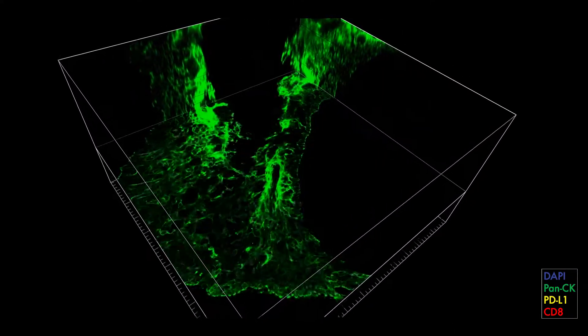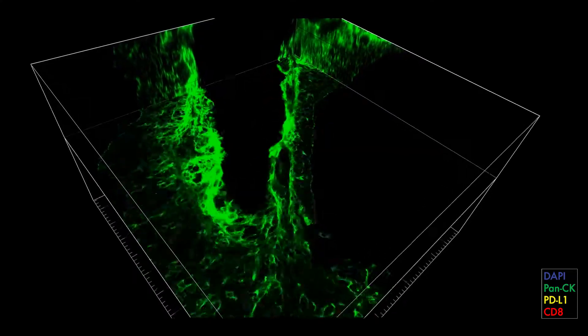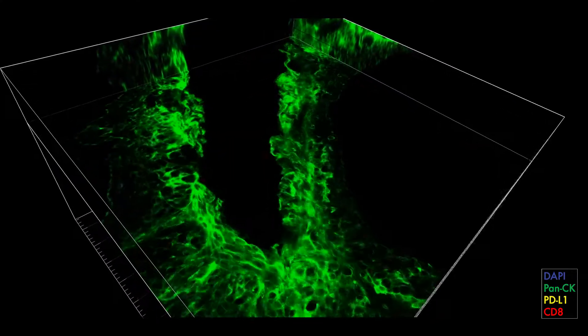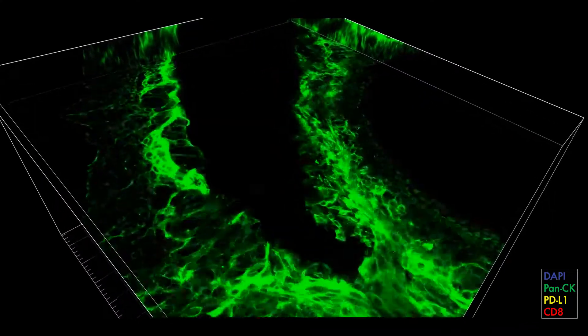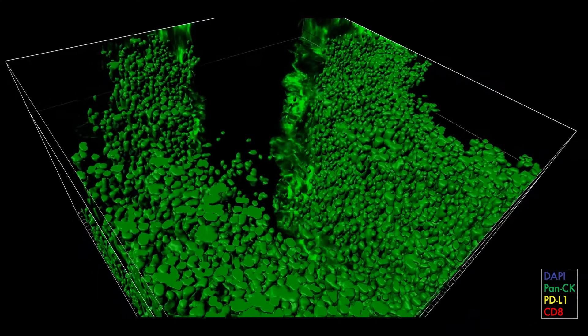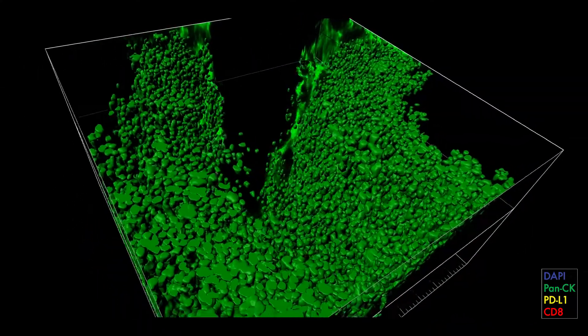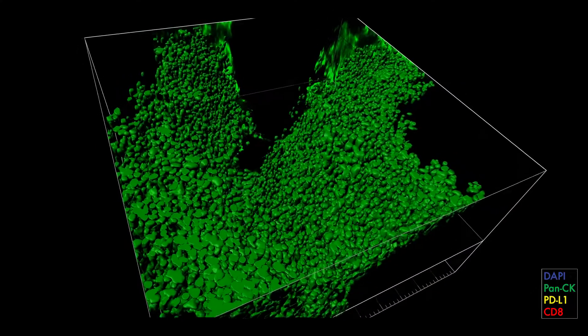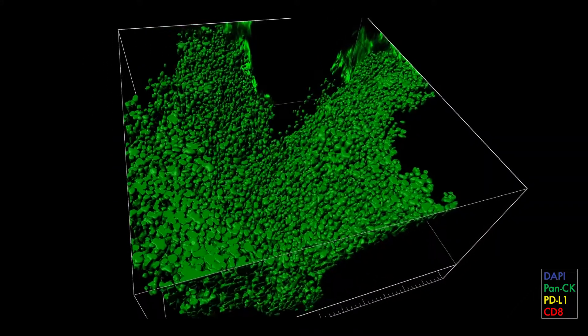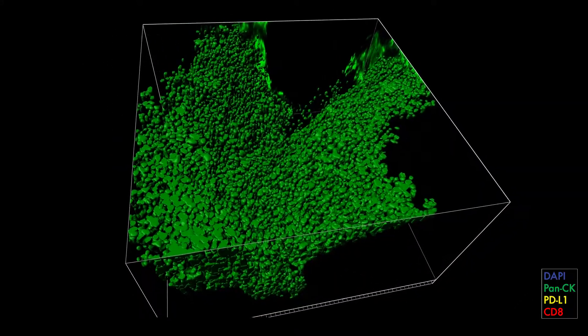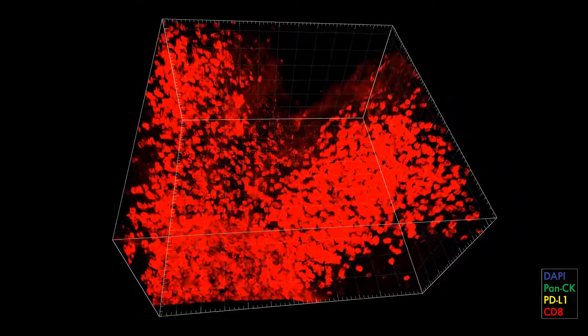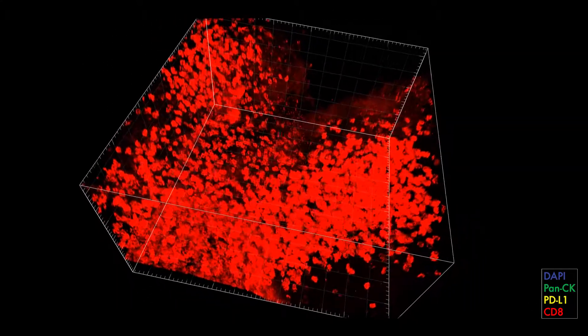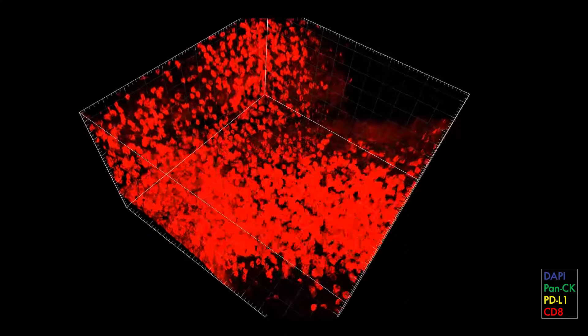Now, you can see PANCK which stains epithelial cells. Finally, you see the CD8 marker.